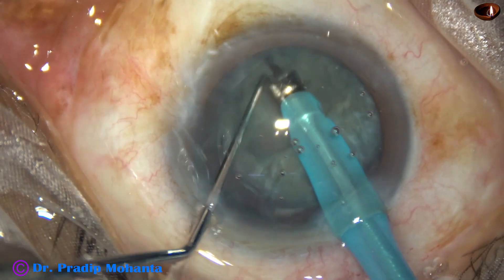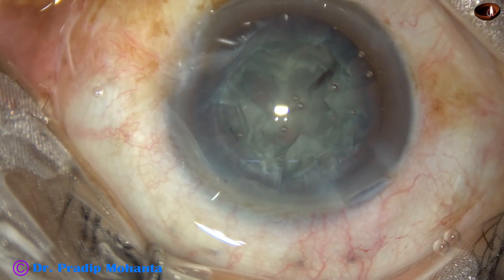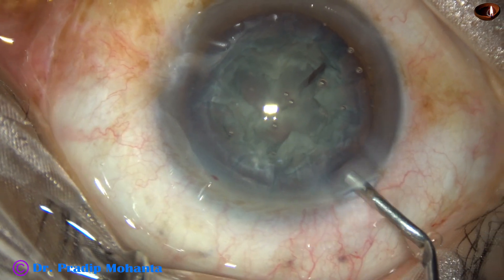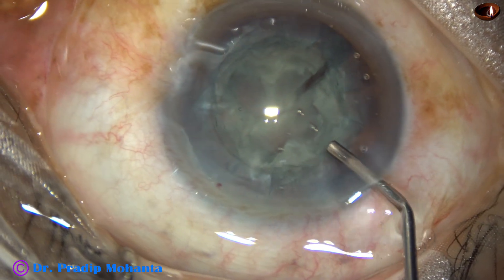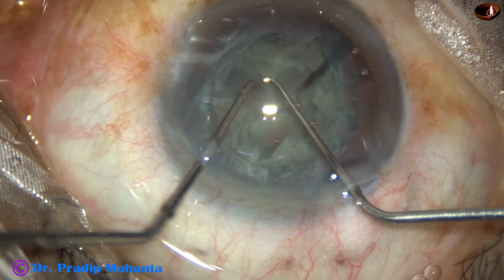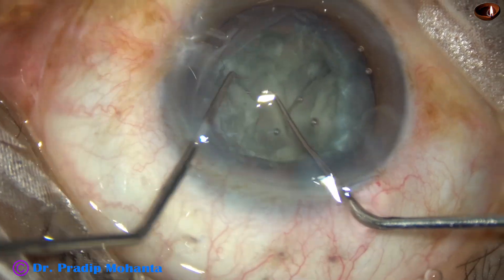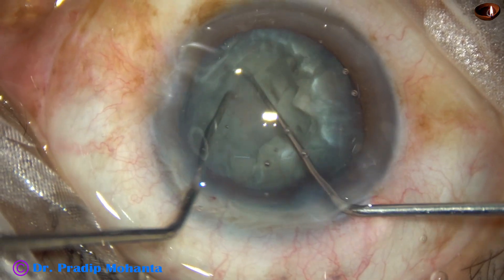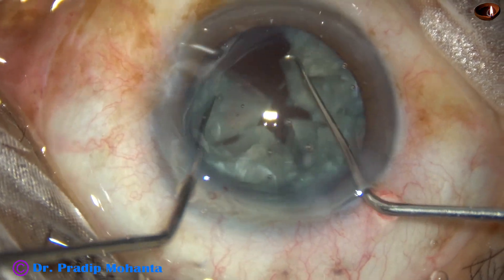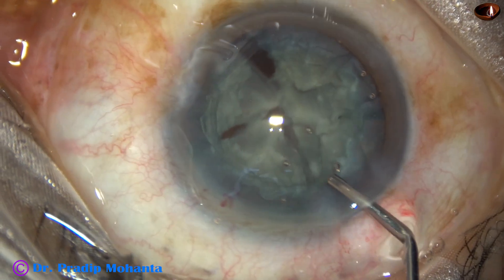It is done. And after applying opposing forces, we can crack the nucleus into several fragments. Beginners can do it with two instruments — it may be easier. These instruments are thin. Go to the floor and apply opposite forces. With two hooks, you can easily separate the pieces.